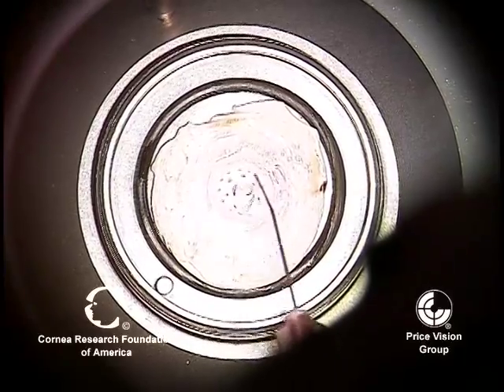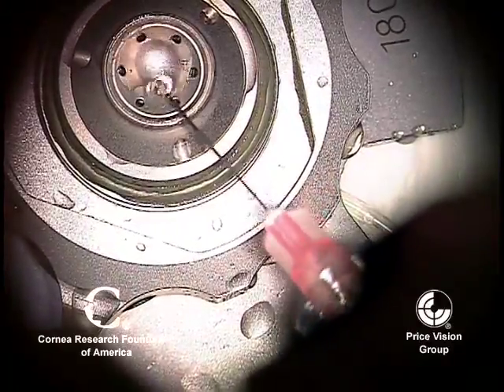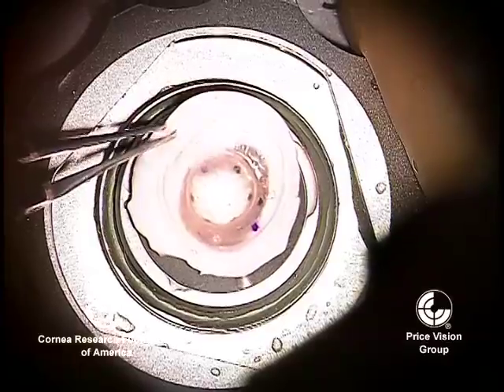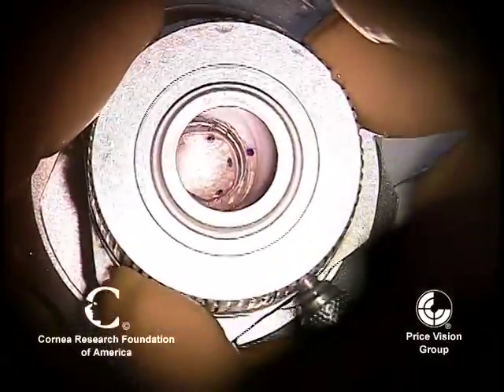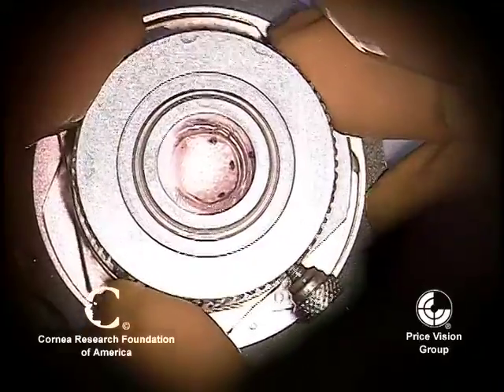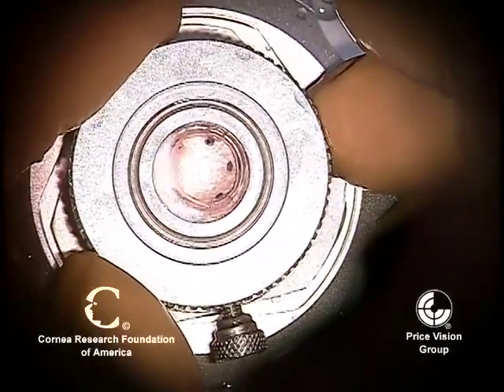We're now coating the side with endothelium with viscoelastic. We're using OcuCoat in this case, and also placing it in the base of the artificial anterior chamber. This is an artificial anterior chamber made by Moria. Now we're going to center this so that the big bubble is in the center — it goes out almost all the way to where the edge of the resection is with the microkeratome, but not quite.